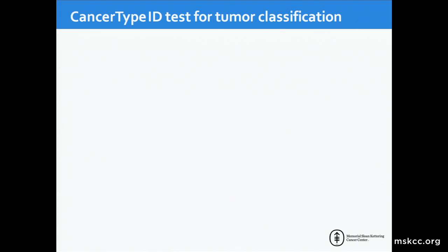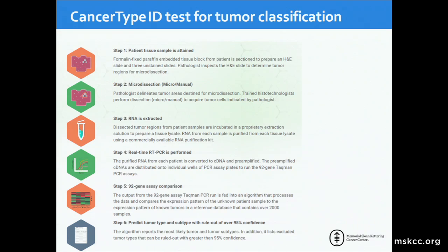Now, this is a commercial test. And as a side note, I do not have any stake in the company. I do not endorse or unendorse, to use some of the language of our times, this particular test. I'm just talking about it because this is what was chosen in this particular case. This is how this test is being performed, and this is from the company website.